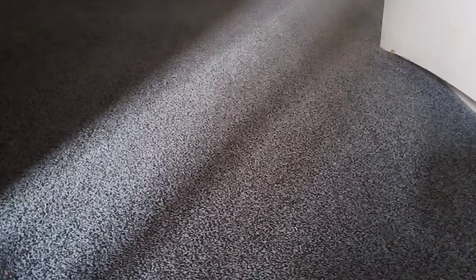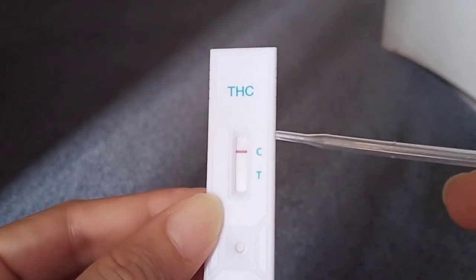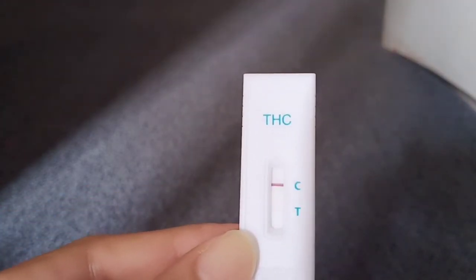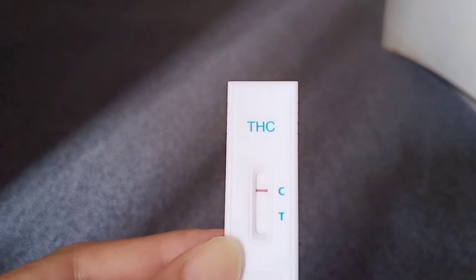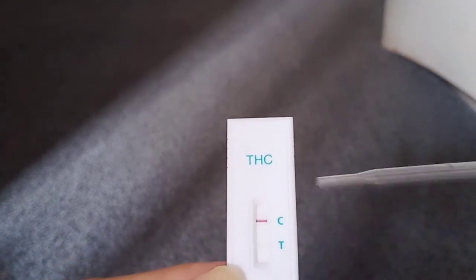I tried one out and it's showing positive — that's because I'm taking my CBD medicine, which has a little bit of THC in it. So it shows up. I'm going to try not taking the CBD for a couple of days and see how fast the test results go to negative.